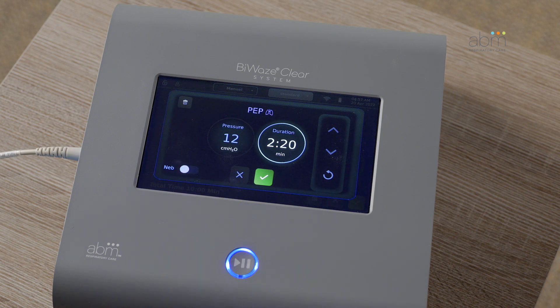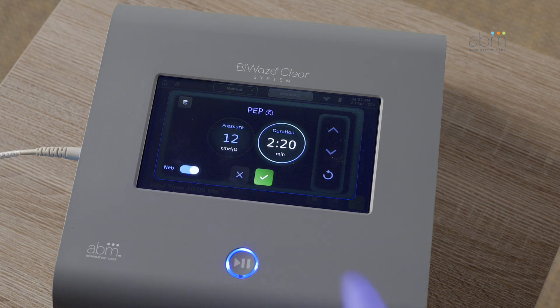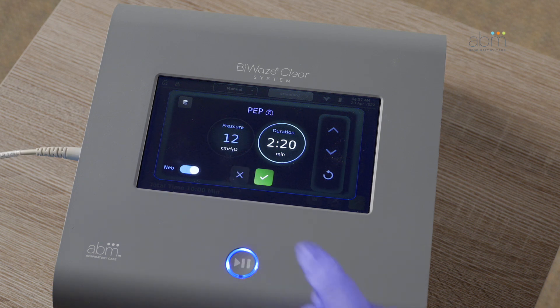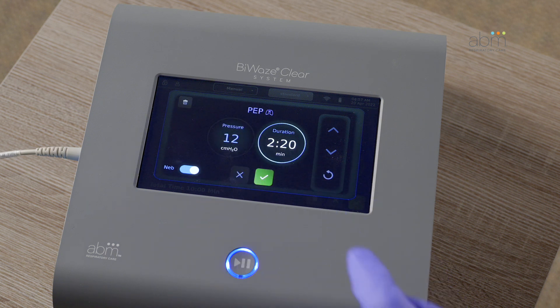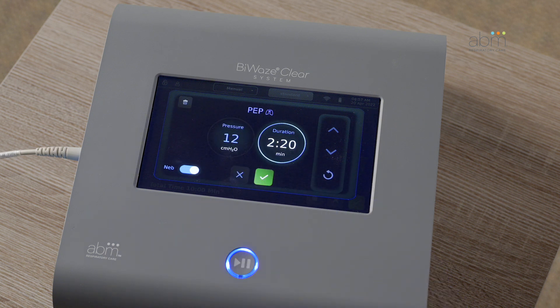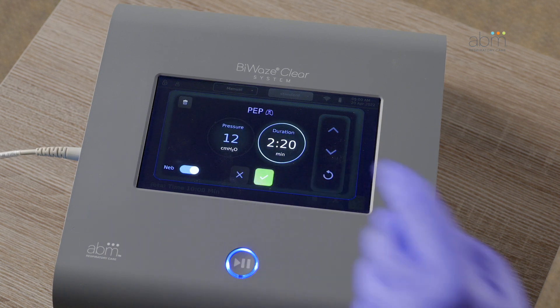The NEB toggle turns the NEB on or off for this particular phase. The trash can icon will remove the phase. Press the check mark to save the changes to the setting.